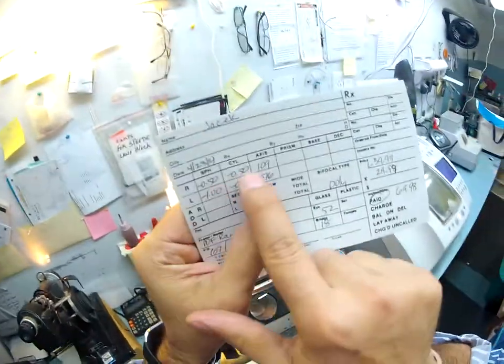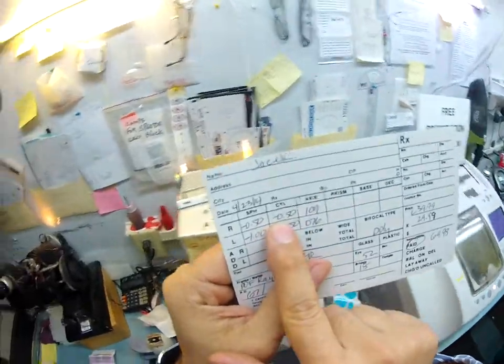If someone owed you 50 cents and then they borrowed another 50 cents, it'd be a combined power of 1, which is what we're reading.